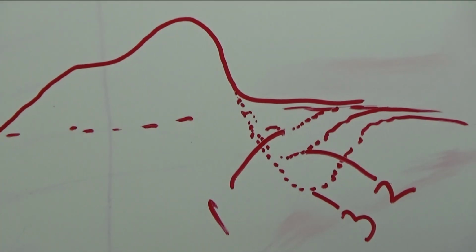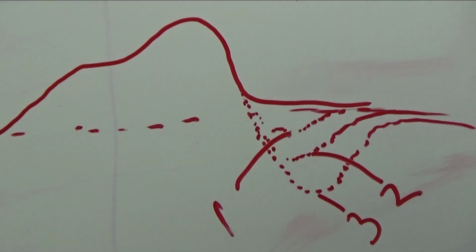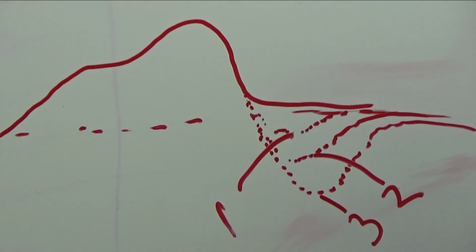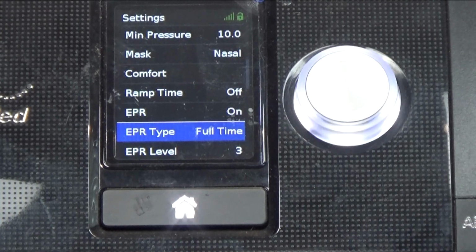Now at this point you might be saying to yourself, oh hell yeah, I just got myself a poor man's bilevel. And that's true, but if someone needs to be on CPAP and they're all of a sudden put on bilevel, it doesn't work out the same. You have a certain level of airway protection, and by that I mean the pressure that is inflating or keeping open, holding open your upper airway. If you mess with that by turning on the EPR, now you're having a lower level of therapeutic pressure. And now you're introducing things like RERAs, hypopneas, things like that can slip through. Many people will say that I'm being a little overdramatic with that, but I would say that's definitely not the case.